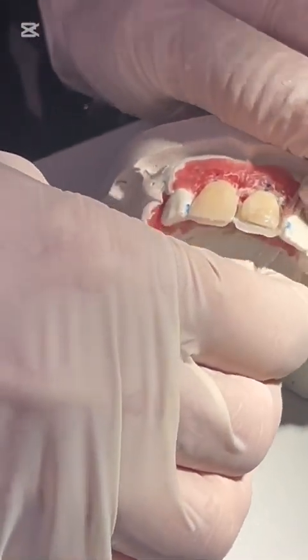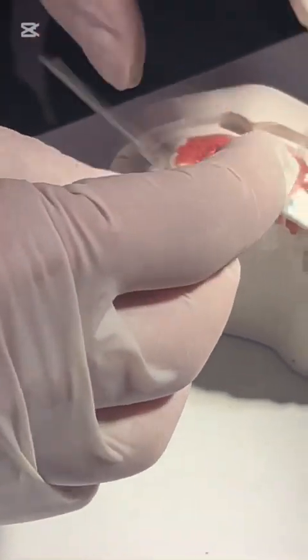What's the name in English of this? Matrix. Translucent. Translucent cellulose strip.